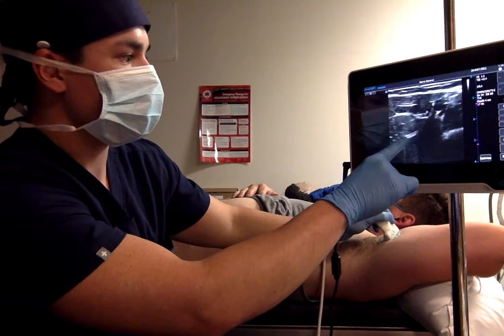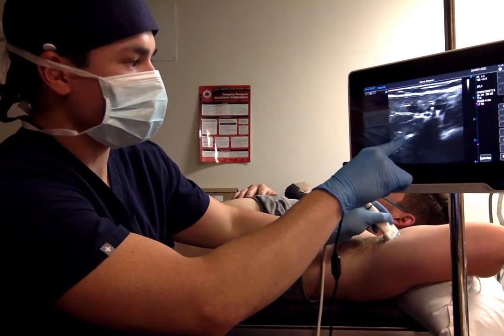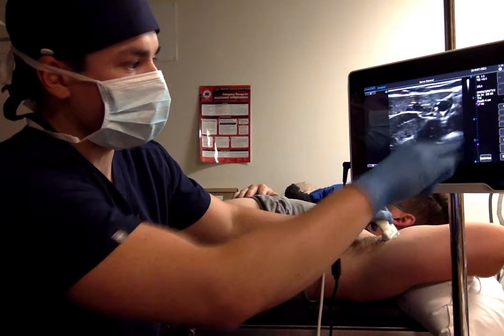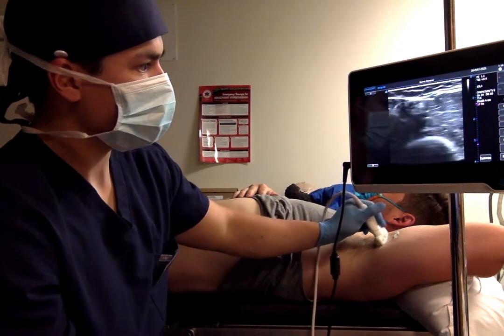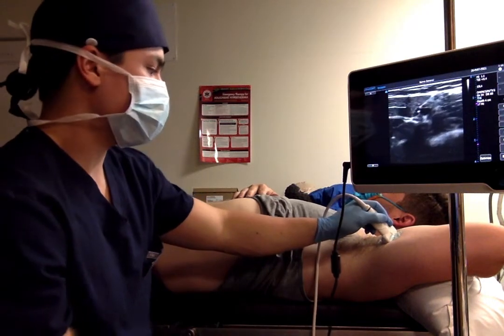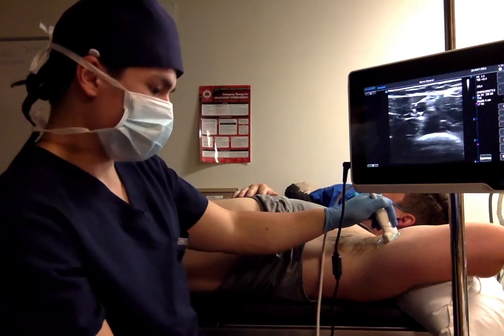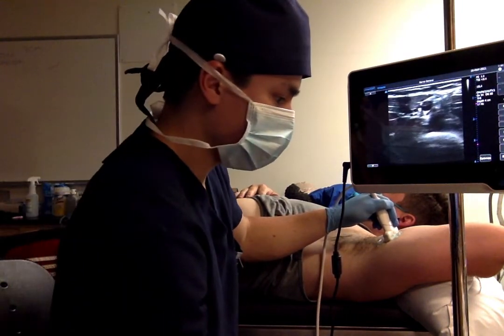I'm going to say this is the median, or the musculocutaneous nerve. We have the triceps down here. So my approach, I'm going to be approaching from a cephalad to caudad position with my needle.